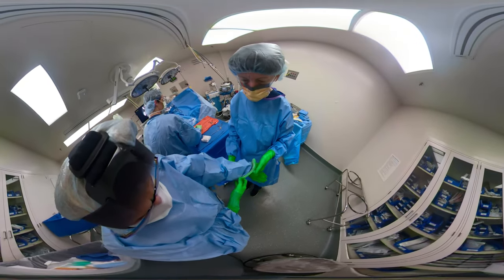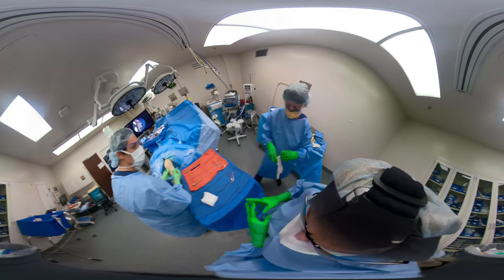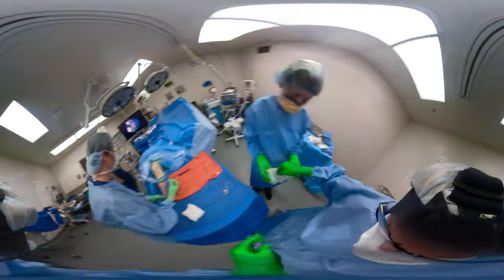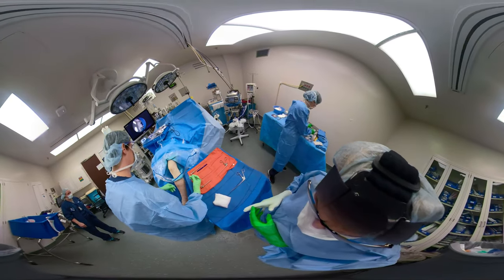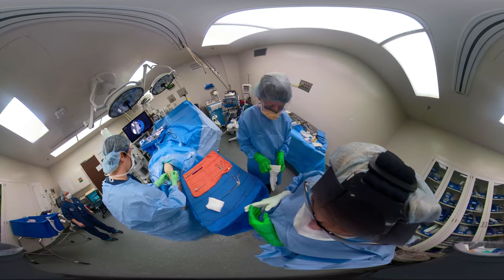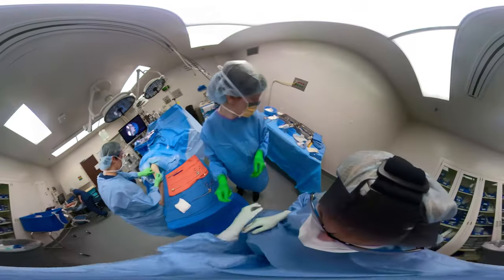I double-glove. This is a left knee in a 45-year-old who has a medial meniscus tear. By clinical exam, he's got catching pain, positive McMurray's test with pain and popping. He also has a localized cyst medially on his MRI scan, which shows a degenerative complex meniscus tear.